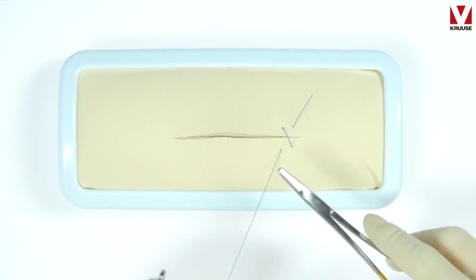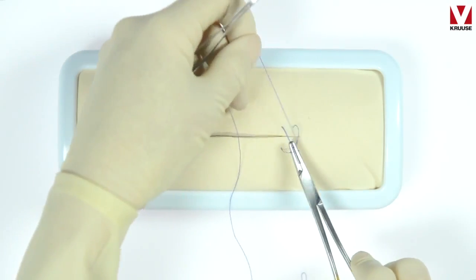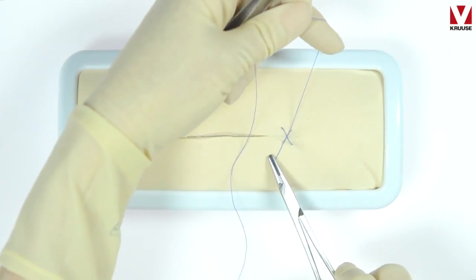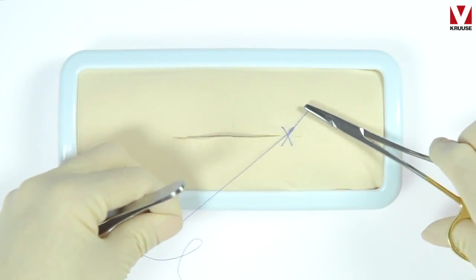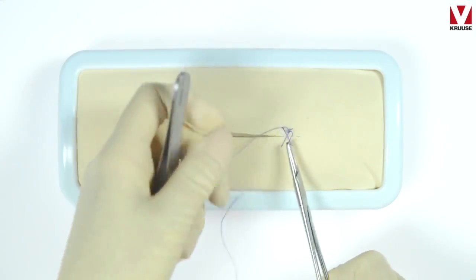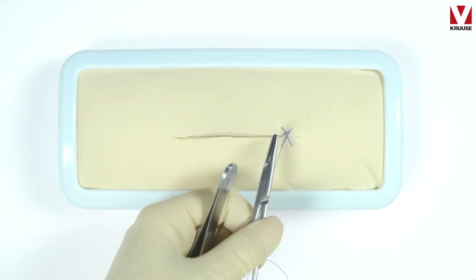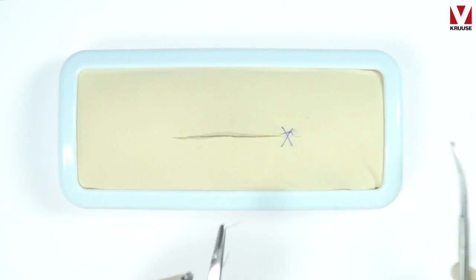When you tie the knot, you can use either a 2-1-1 or a 3-1-1 throw. Here we make a 2-1-1, and be careful when you tie the first knot on top of the two throws that you position the knot laterally to the incision and not on top of the incision.